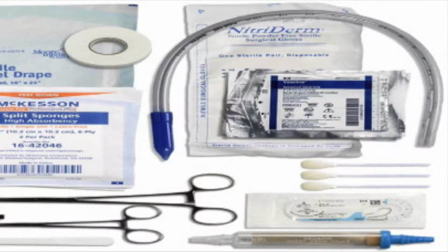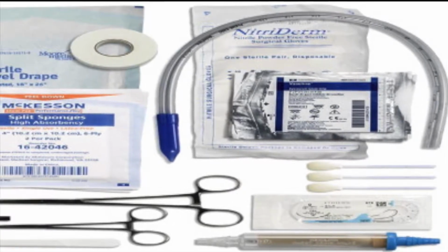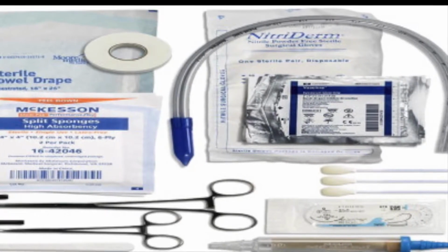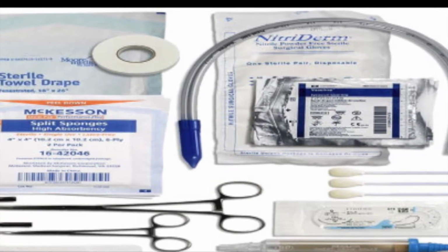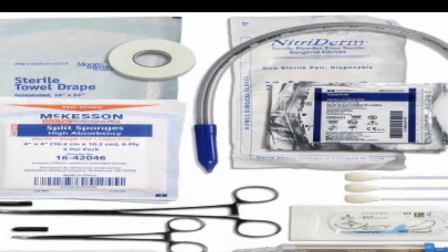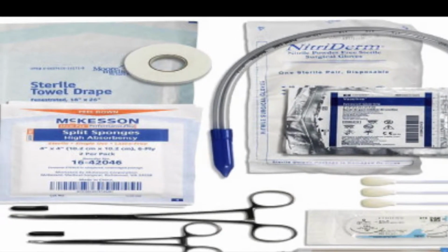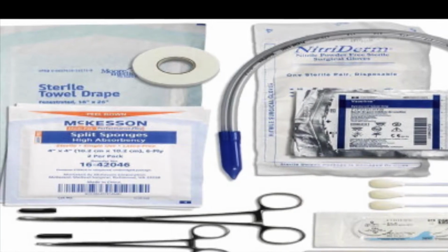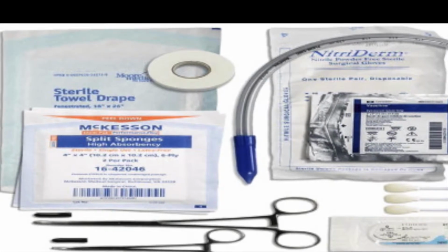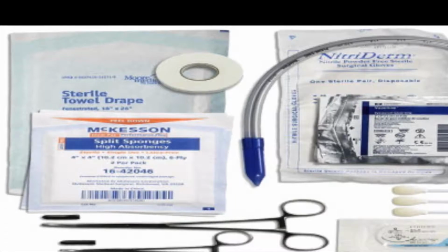If you are just maintaining a chest tube, you should determine when the last dressing change was performed, and then there are supplies you will need: sterile gloves, petroleum gauze, which is optional, a 250 milliliter bottle of sterile water, 4x4 gauze sponges, a complete drainage system to include tubing, skin cleansing solution, and the adhesive tape or foam dressing.